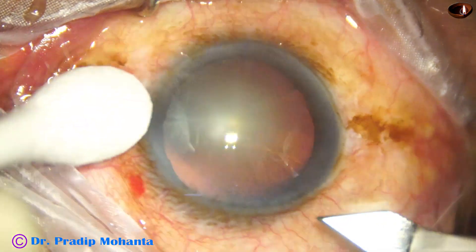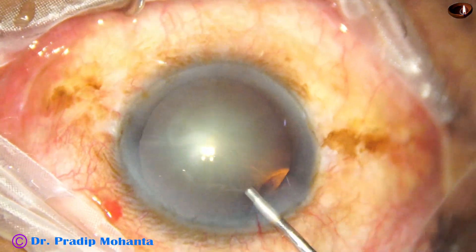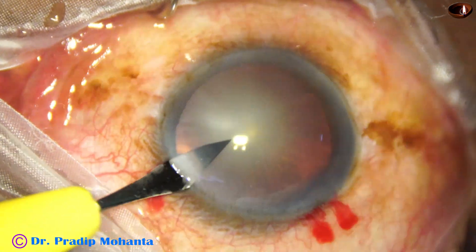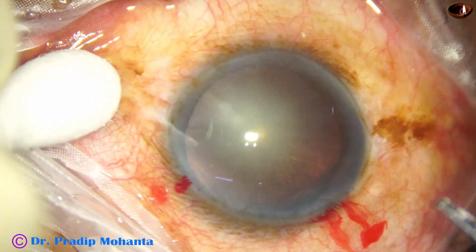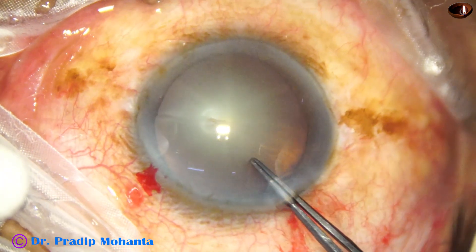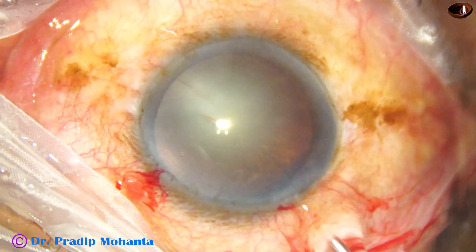The main incision is being placed at 11 o'clock. The anterior chamber is filled with 2% OVD. A side port is made on the left side of the main incision. Now see what happens as I try to do capsulorhexis with the utrata forceps — the whole lens moves, and there is a gap from 10 o'clock to 1 o'clock, a very minute gap.